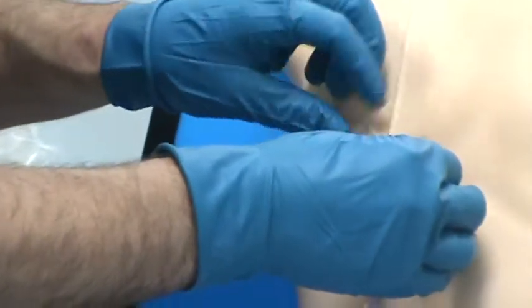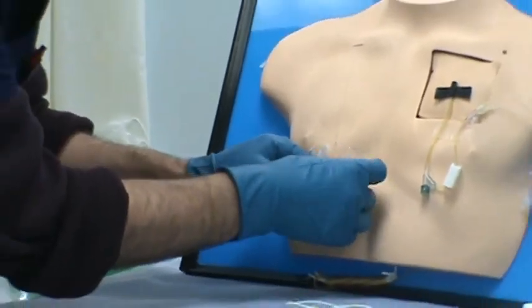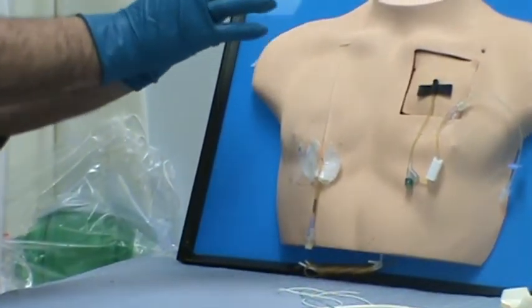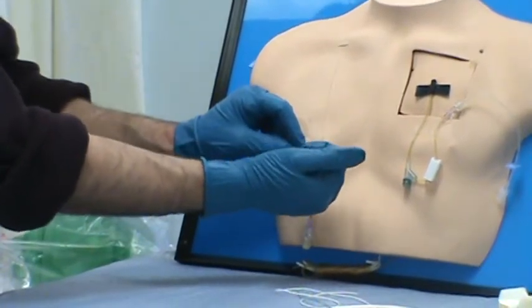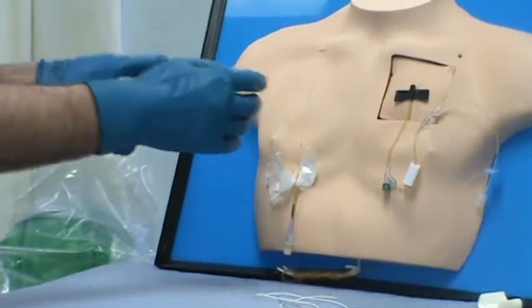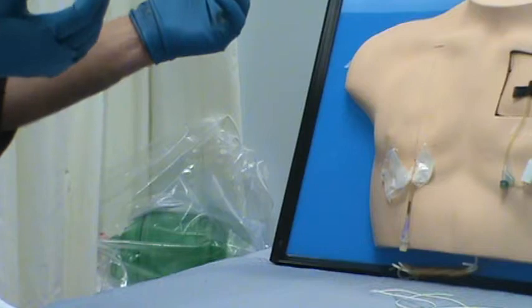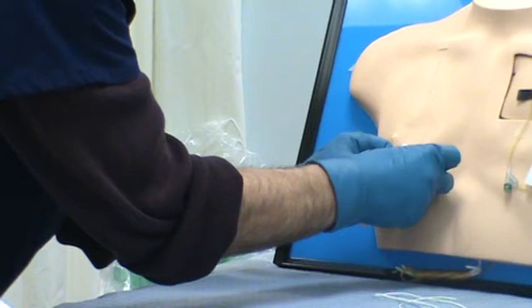So now, I will take this off, and I'm being very careful. When I'm taking this off, I'm trying to pull up and away, although it's very difficult to do, because when you're pulling down, you could pull this out. So I'm trying to be very careful on how I'm pulling this thing. And if I didn't have on sterile gloves when I started to take this off, when I saw that thing on backwards, I would put sterile gloves on. Because, like I said, this is really difficult to do when it's twisted around backwards like that.